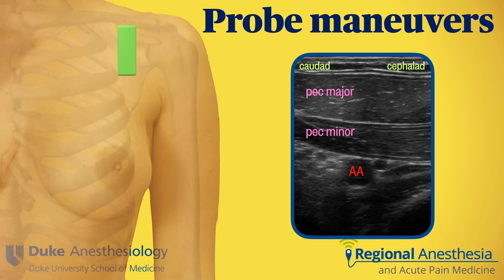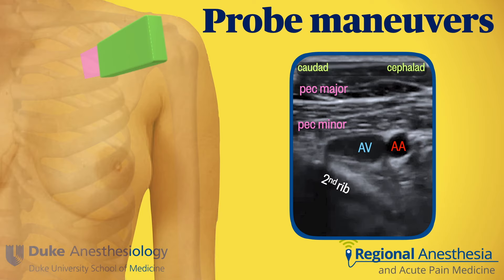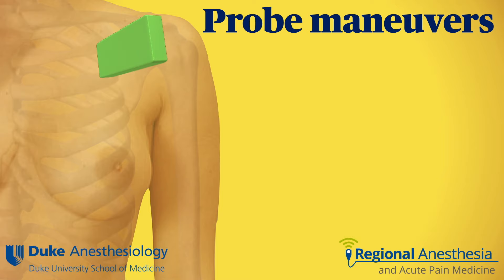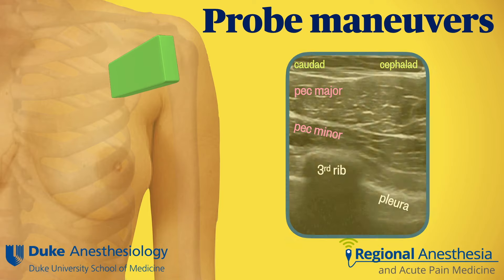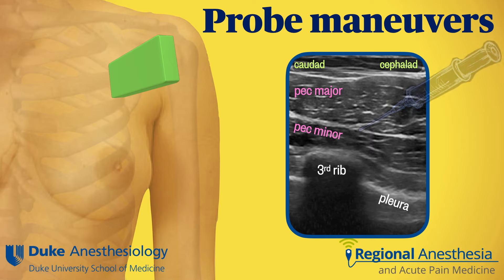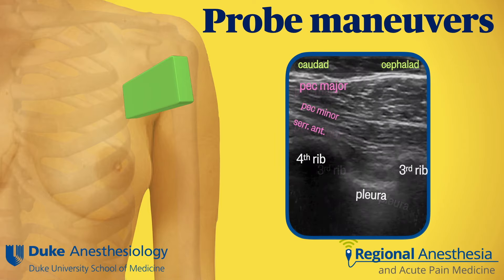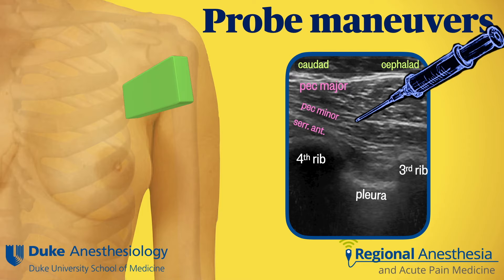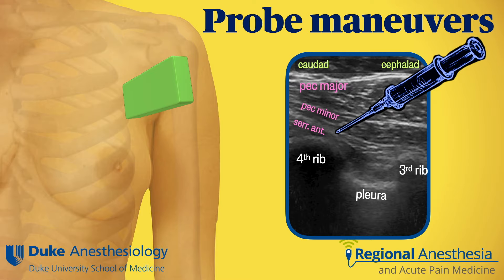There is a sequence of important probe maneuvers to see the correct anatomy and increase block success. First, tilt medially and then twist so the transducer is in line with the deltopectoral groove — this brings the chest wall into view underneath the axillary vessels. The rib directly underneath the axillary vein is the second rib. Translate inferiorly and laterally to find the third rib, where you can appreciate the fascial plane between the two pec muscles — the target for pecs 1. Continue inferolaterally to the fourth rib, where serratus anterior appears under pec minor; the plane between these two muscles is the target for pecs 2.